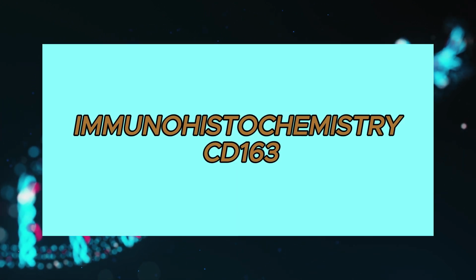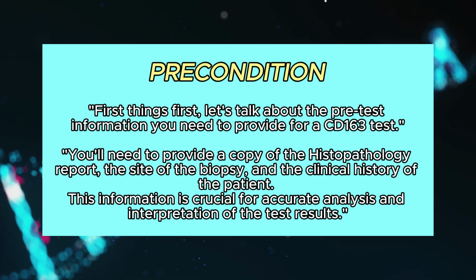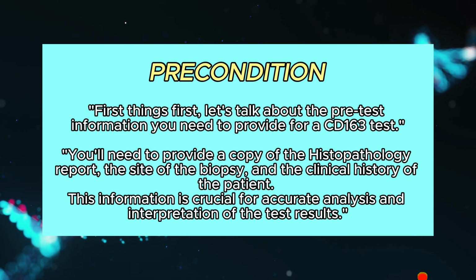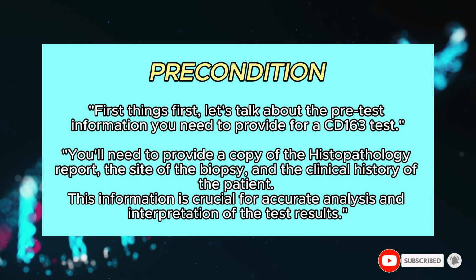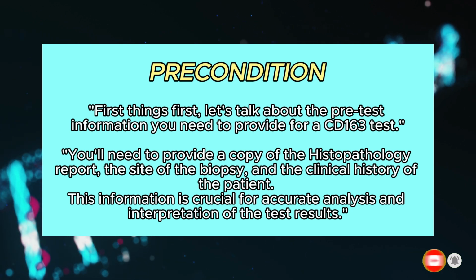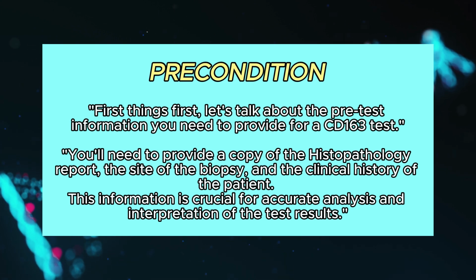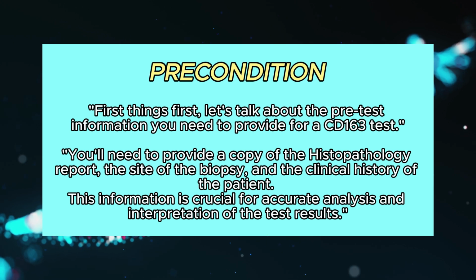Let's get into it. Pre-test information. First things first, let's talk about the pre-test information you need to provide for a CD163 test. You'll need to provide a copy of the histopathology report, the site of the biopsy, and the clinical history of the patient. This information is crucial for accurate analysis and interpretation of the test results.